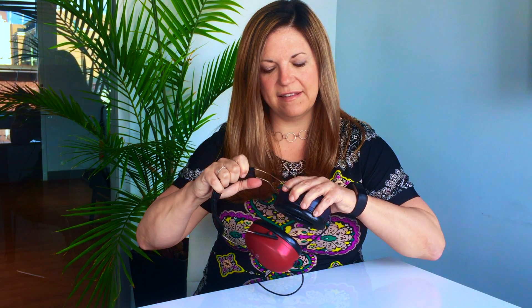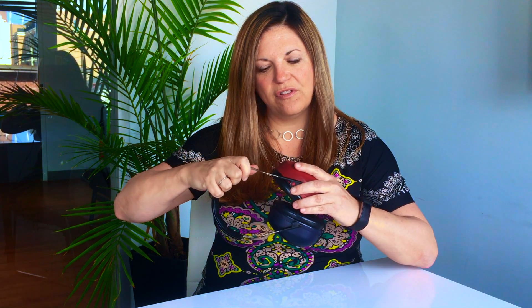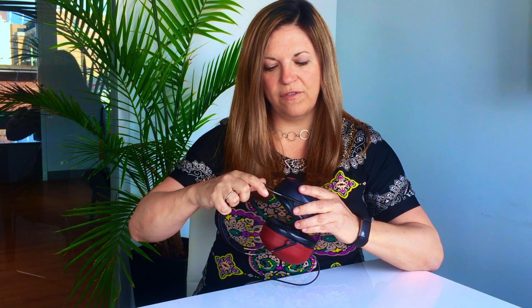Secondly, it's easily adjustable to a vast array of head sizes, from your large head sizes all the way down to your smaller head sizes. I've tested these in their original configuration on children as young as 3 years old without issue.